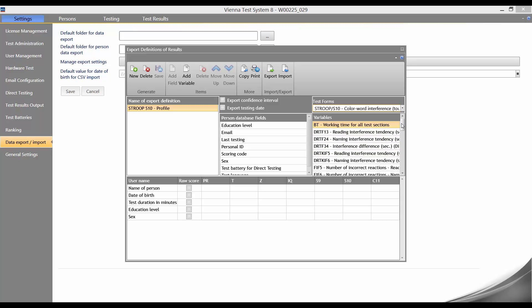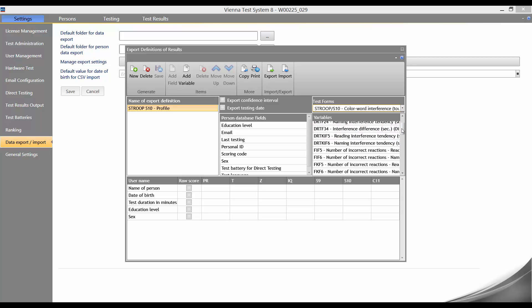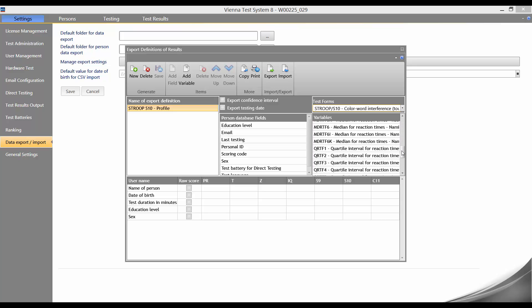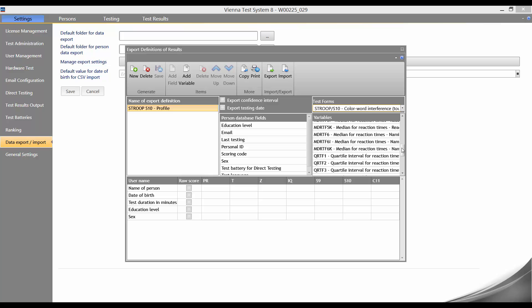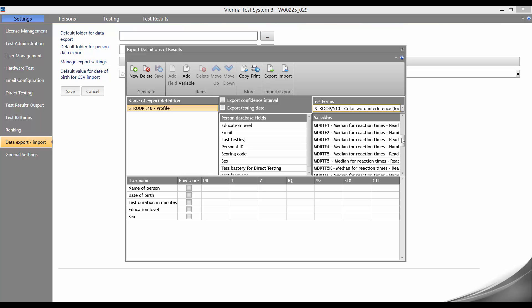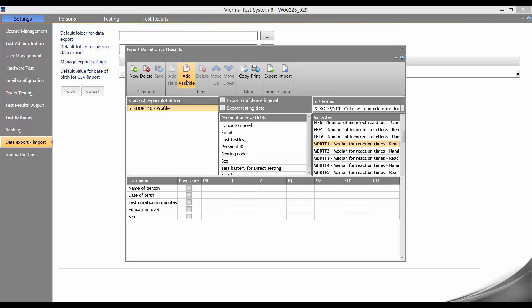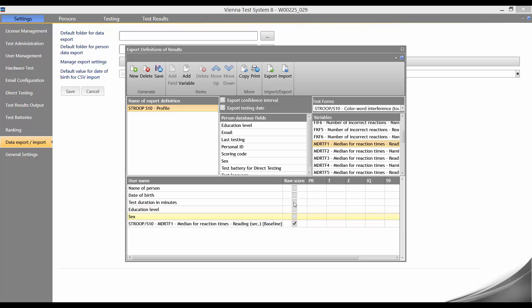All the variables of Stroop S10 that we can select for our export definition are now displayed below. Now we want to add the variable MDRTF1. To do this, we select the variable and click on add variable at the top here in the menu. The variable then appears down here in the variable list with a tick next to raw score.